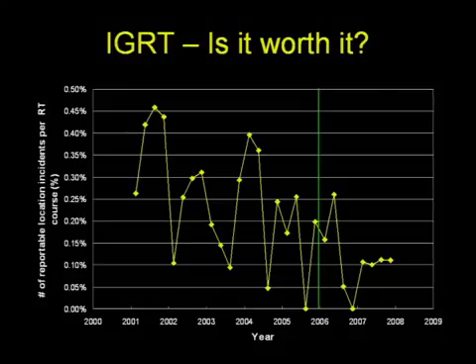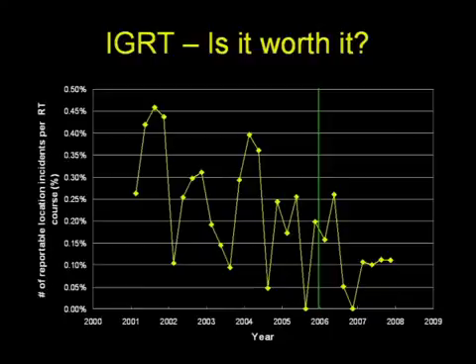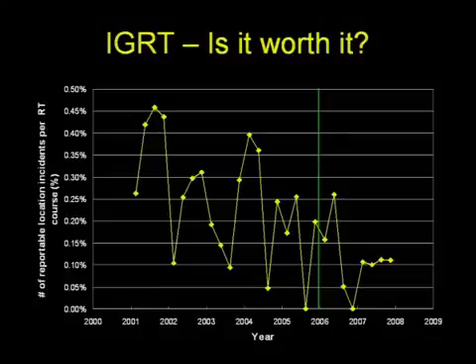Now, IGRT, is it worth it? I'd like to close this session with this graph, which shows a view of our localization incidents that have been reported through our risk management system. It compares the period before, from 2001 to 2006 and on, where we implemented IGRT, showing a significant decrease in the severity and the number of incidents related to geometry since the partial implementation of IGRT.